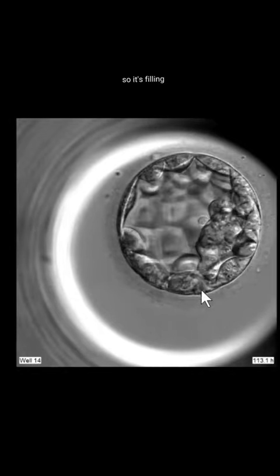So it's filling. You can start to see the inner cell mass here. These are the cells that become the fetus, and the rest of the cells, everything else, is the trophectoderm. And remember, this is a fluid-filled sac. So this is just like a ball of cells filled with water, and you can see the cells along the side here, cells in the background, and the inner cell mass is inside this ball, this sac of water.